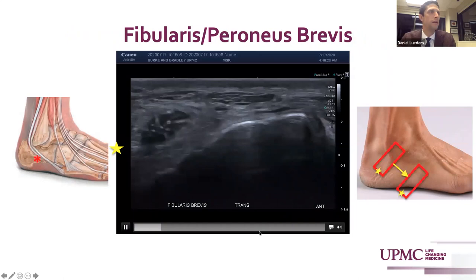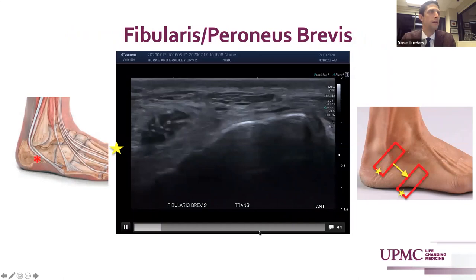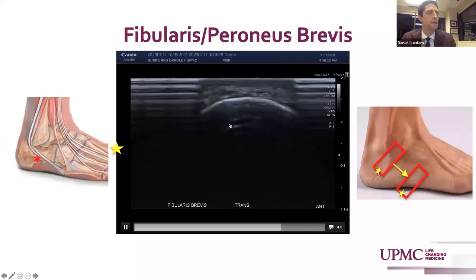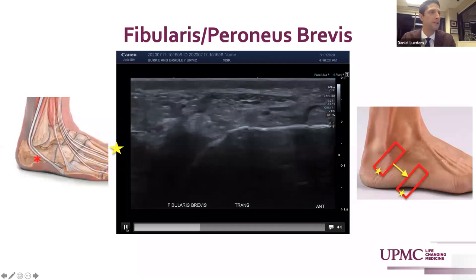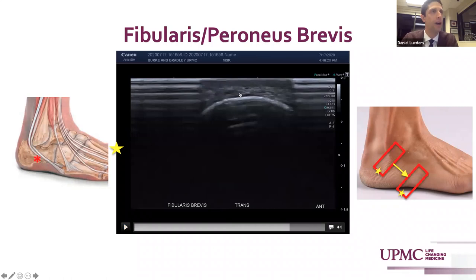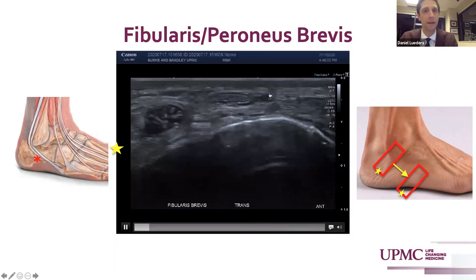Peroneus brevis, as it courses beyond the lateral malleolus, will course down to insert into the base of the fifth metatarsal. It becomes more flattened and widened as it takes its broad insertion into the base of the fifth metatarsal. This image demonstrates that in long axis — we see its distinct tendon rising up superficially to have its broad insertion into the fifth metatarsal.